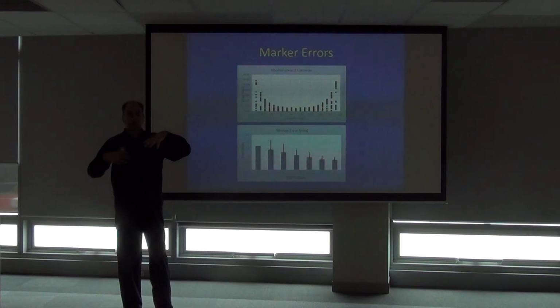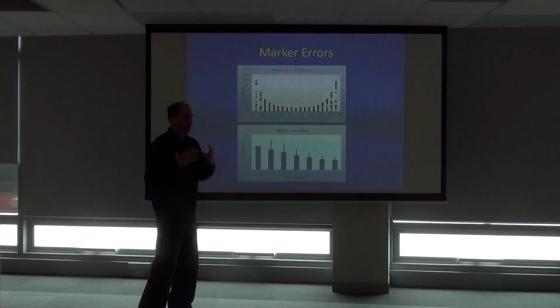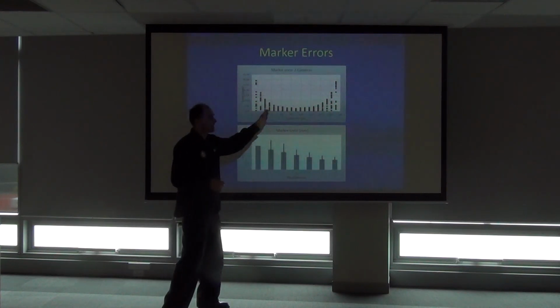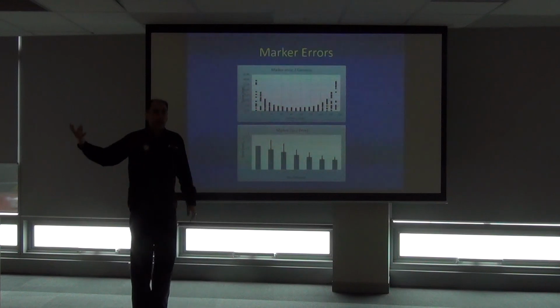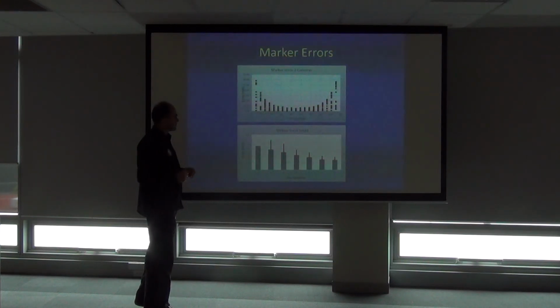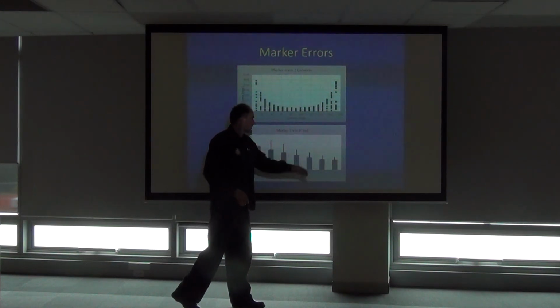So markers included in your model, in your least squares, should be from 3 cameras. If they're from 3 cameras in the least squares procedure, then it's not dependent on camera angle. If it's from 2 cameras, it is. There could be some large errors in that reconstructed point. We've got to screen it against expected RMS error for that segment, to make sure it has not adversely affected the reconstruction or influenced the position. Then marker error in terms of cameras, it's 2 cameras, 3, 4, 5, 6, and 7 cameras.